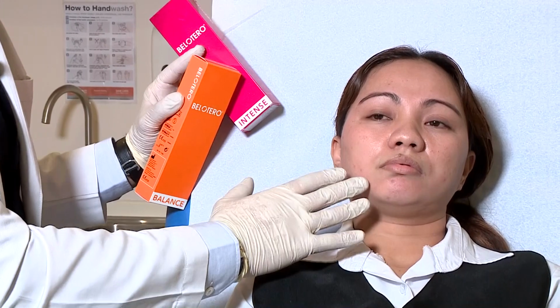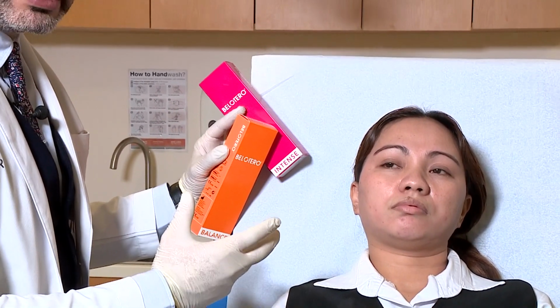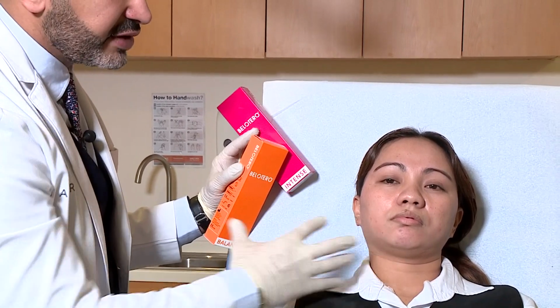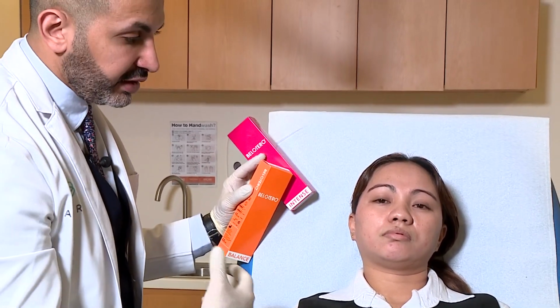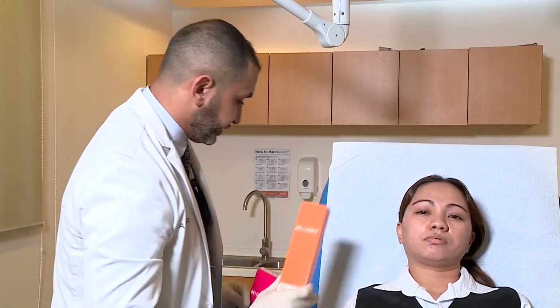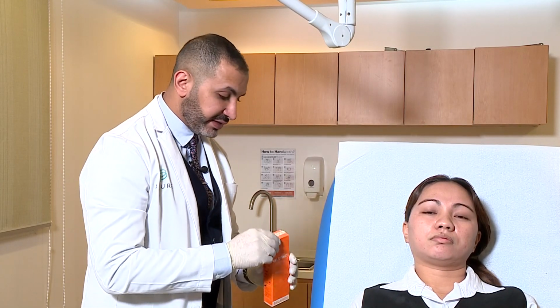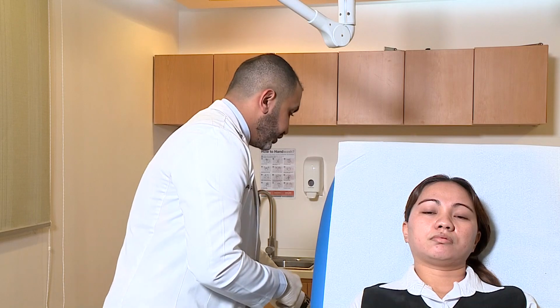I think this is the most popular case that we see in the clinic: medium, nice volumizing of the lips, but she needs more rejuvenation, a younger look, and a little bit of volumizing. So we will use Belotero Balance here. If we were looking for more volumizing, I would use Belotero Intense. We will use Belotero Balance now.